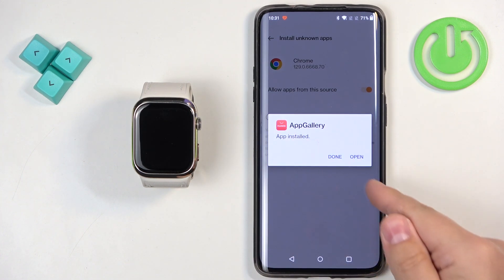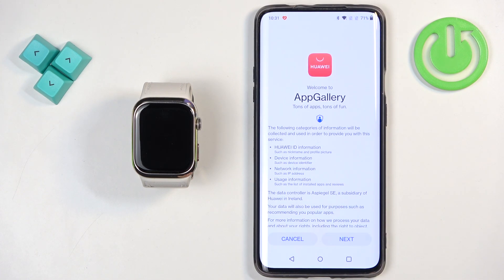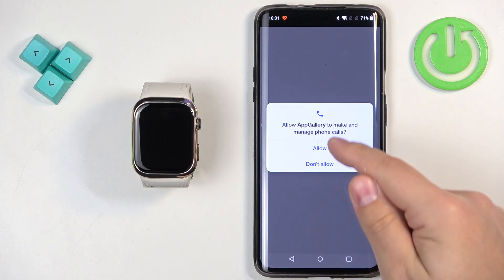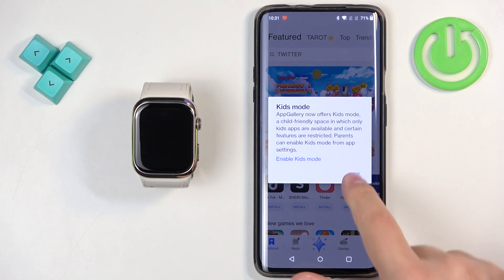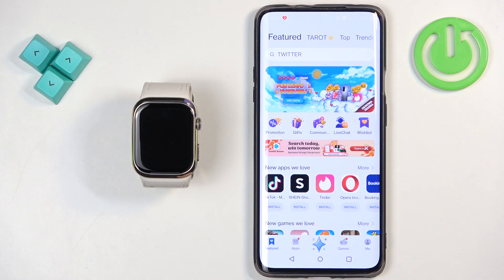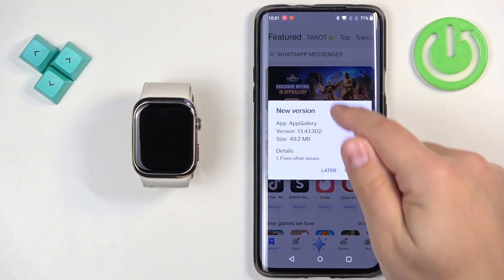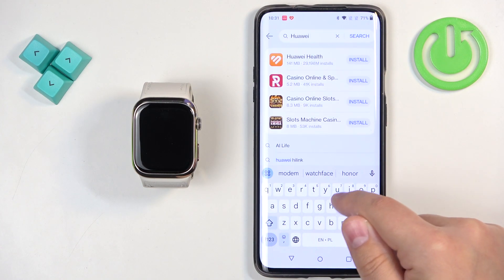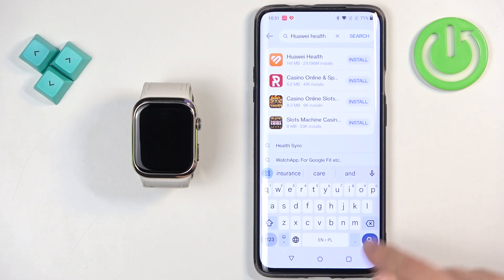Then tap on install to install the App Gallery. Once the App Gallery is done installing, you can tap on open to open it. In the App Gallery, tap next, agree, and allow ordinary permission. After a couple of seconds you should see the main page of the App Gallery. Now we need to find Huawei Health, so tap on search and type in Huawei Health, then tap on search.